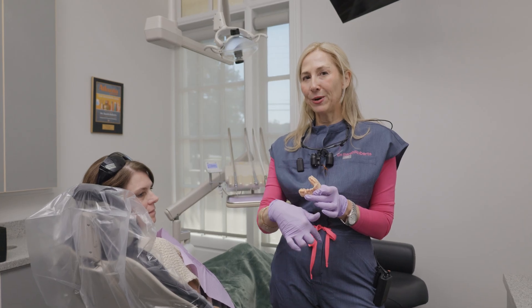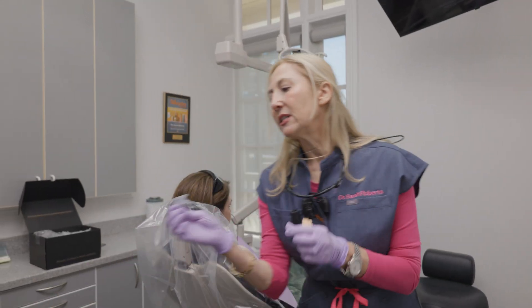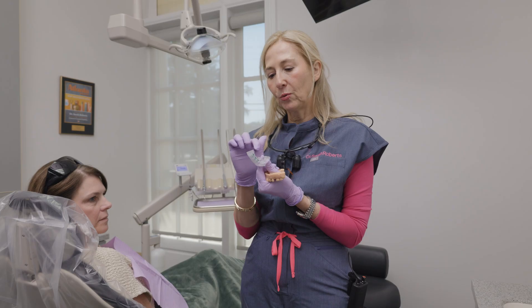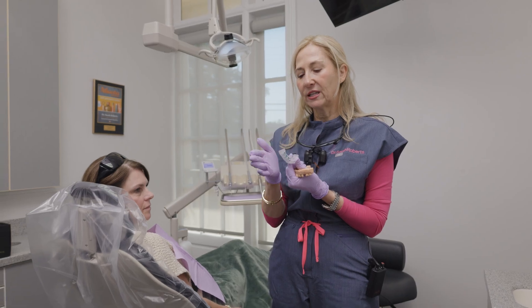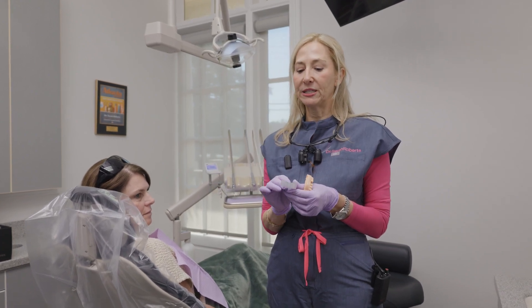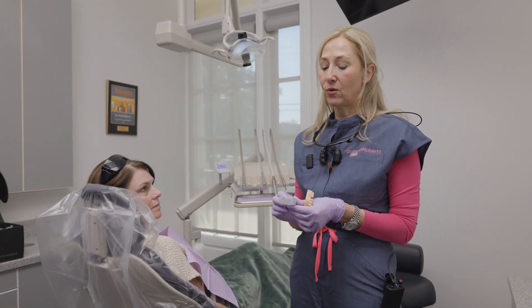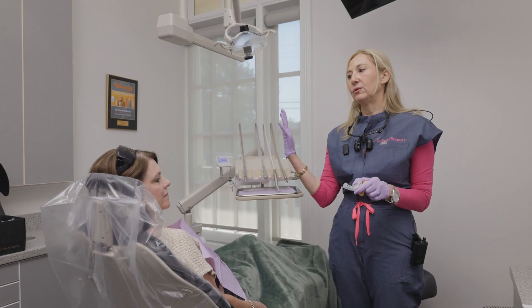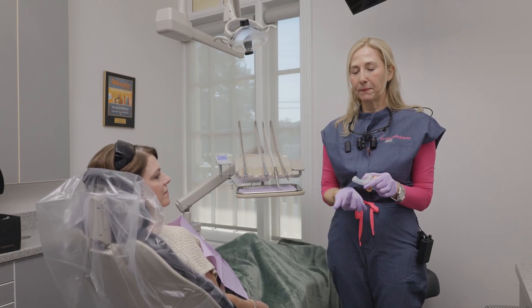I make just a little incision right where it goes, and the implant is placed through that hole in the surgical guide. There's no more making large incisions and pulling the gums back to eyeball where it needs to go — it's all done very precisely. That precision means fewer complications and less pain. This guide acts like a road map, joining the smile and the bone together to achieve precise placement.